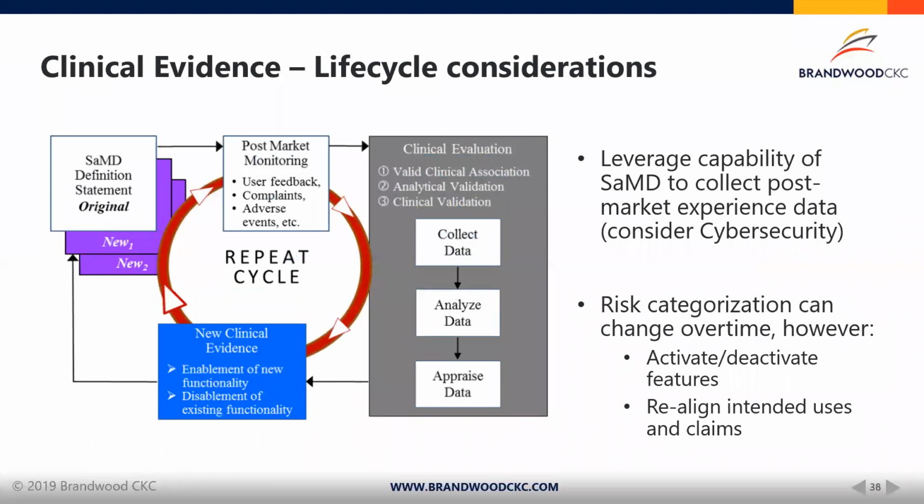So a very important factor is life cycle in software development. Software has that unique position of having the ability to evolve easily. Development cycles are fast, and there is a unique opportunity at the same time for software to collect use data in the field. So that's a unique advantage. This is something that should be built in and embedded in the software development plans.